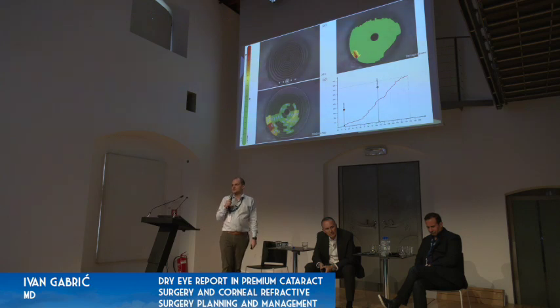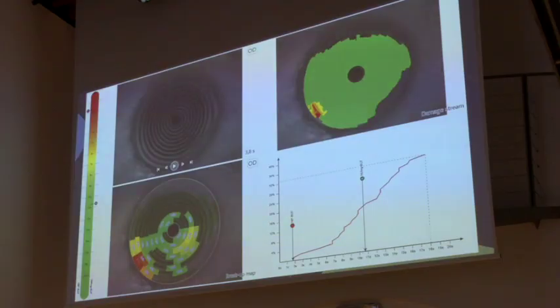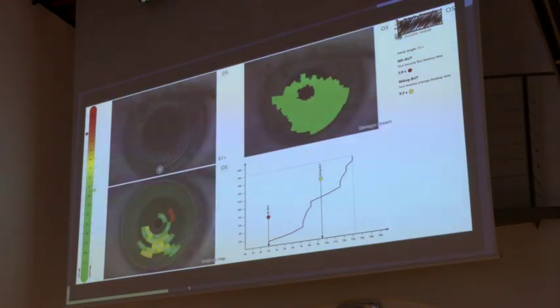This is, can we play the video? This is what I like to actually show my patients. I turn on the damage stream. Simona? Yeah, okay, here it is. This one's of the video.